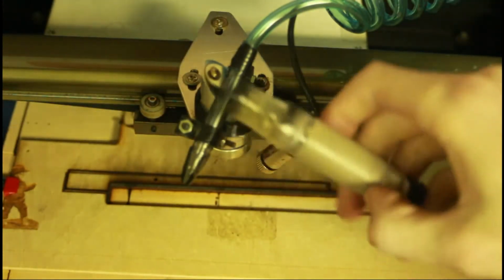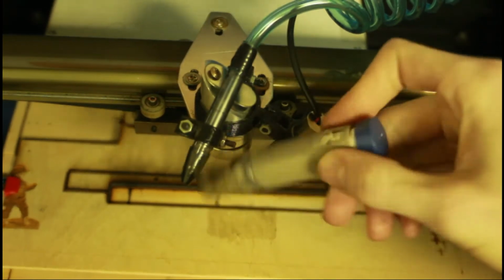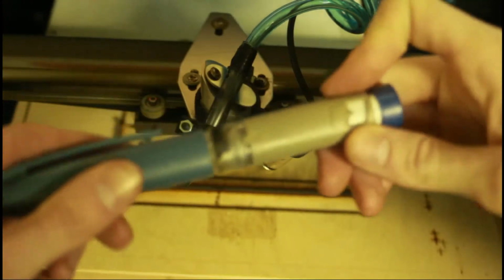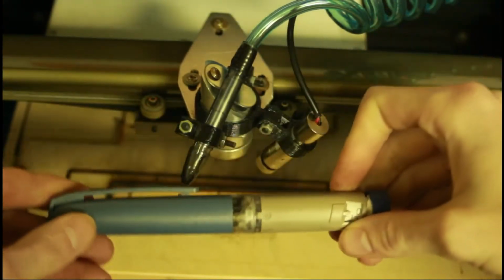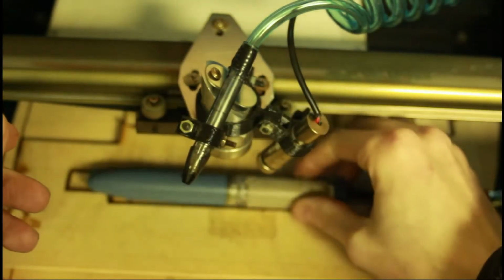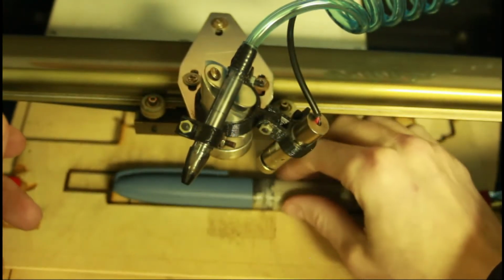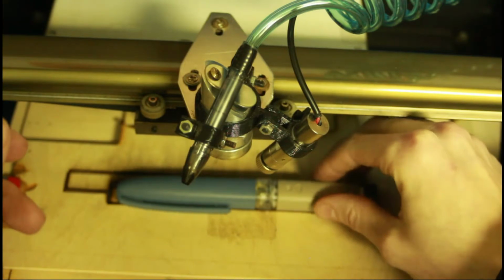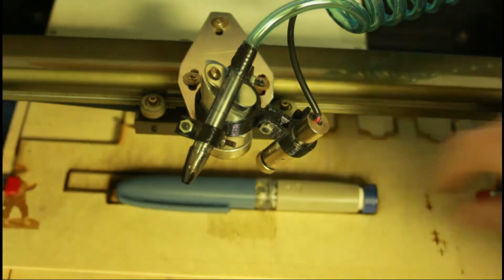And for the pen cap, we're actually going to use a dummy piece from another pen that just didn't quite make the cut, right? We're going to fit that on here like that because they all fit the same anyway. And we're going to use that to make it easier for the laser to know exactly where to cut. Okay? So let's get this done.